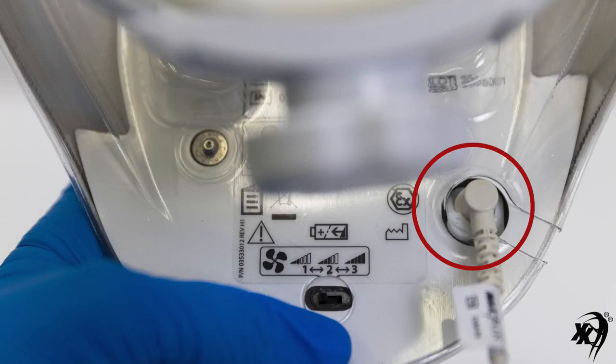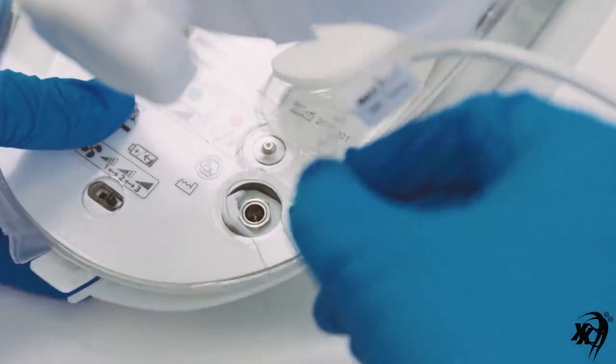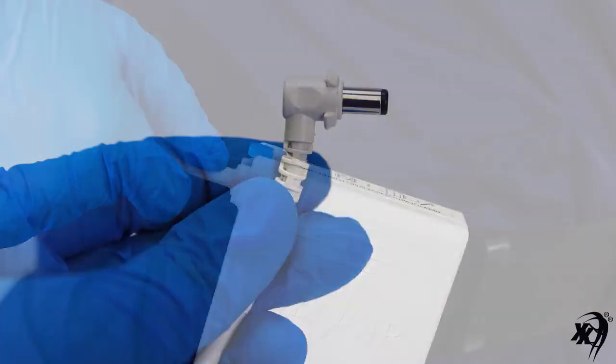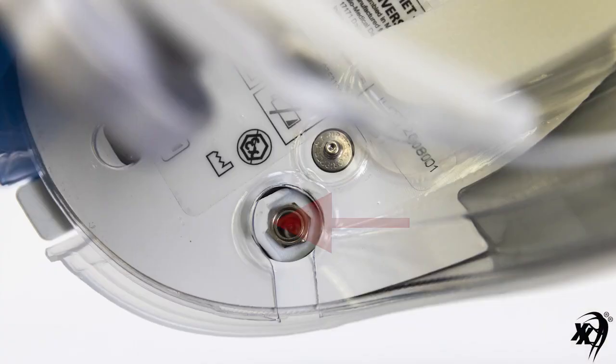The rear underside power cord turn lock connector allows for a secure and quick connect and disconnect of the helmet to the battery power cord. To connect the right angle notch power cord connector to the helmet, first match the cord connector notch to the extended portion of the helmet turn lock connector.